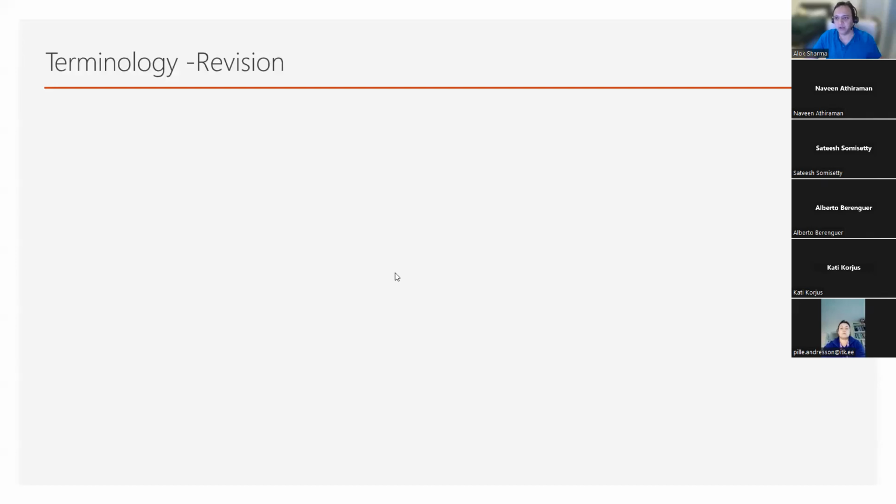Okay, so I am going to start with a little bit of revision. The aim of today's topic is to give you an introduction to standardization of nomenclature and terminology. This is the standard terminology that we are going to use throughout the course. It's also very important because from our perspective, it is pretty much the standard that's used across most of Europe and by most of our Chinese counterparts with a few modifications.